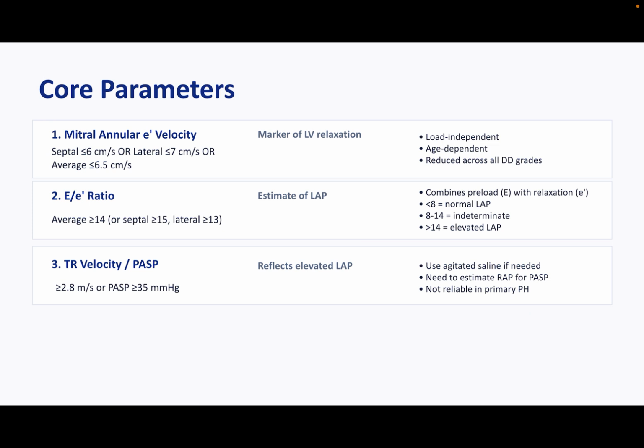The 3 parameters were chosen because they assess 3 different aspects of the filling pressure problem: myocardial relaxation, transmitral driving pressure, and downstream pulmonary vascular response. Together, they're more powerful than any single parameter.